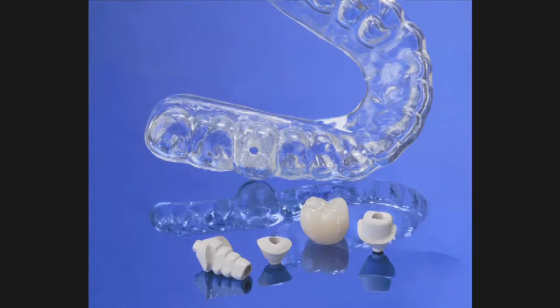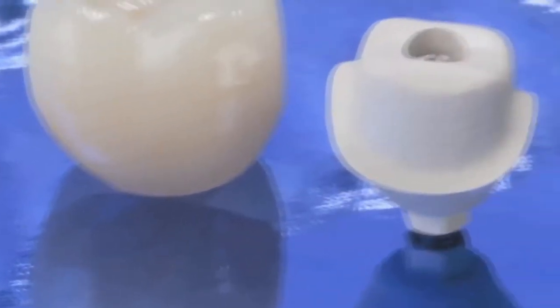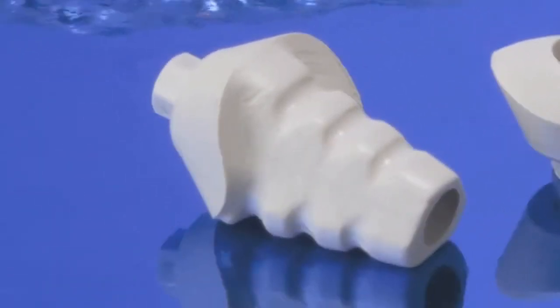This is completed with custom milled healing abutments, maximizing ultimate tissue contours, custom milled transitional or temporary abutments used to support the transitional prosthetic appliance or temporary bridge or crown, and custom milled impression copings which mimic the tissue contours created by the healing abutment or transitional abutment.